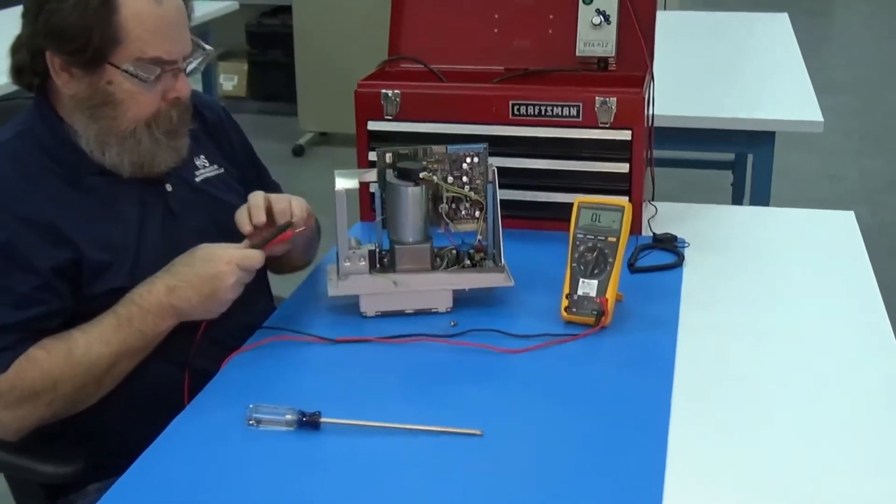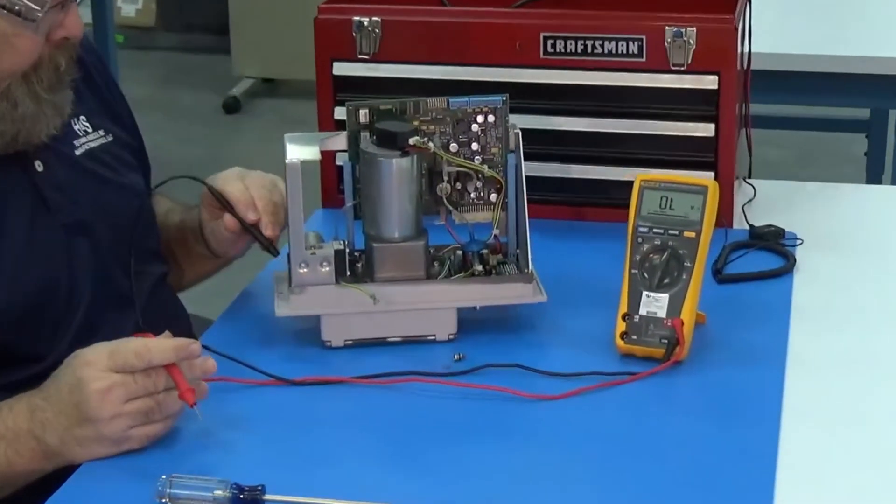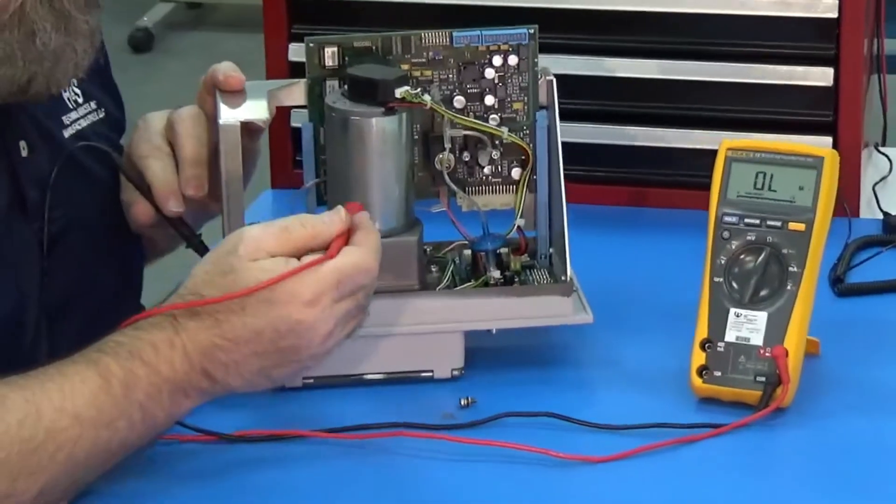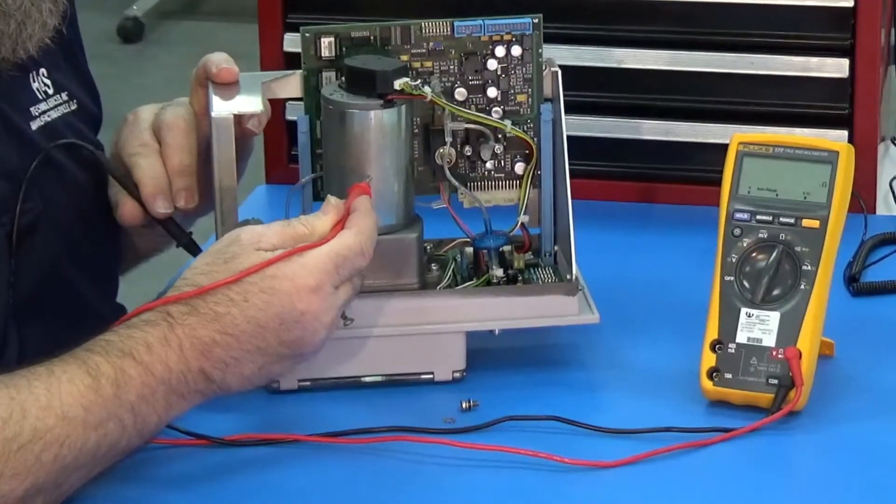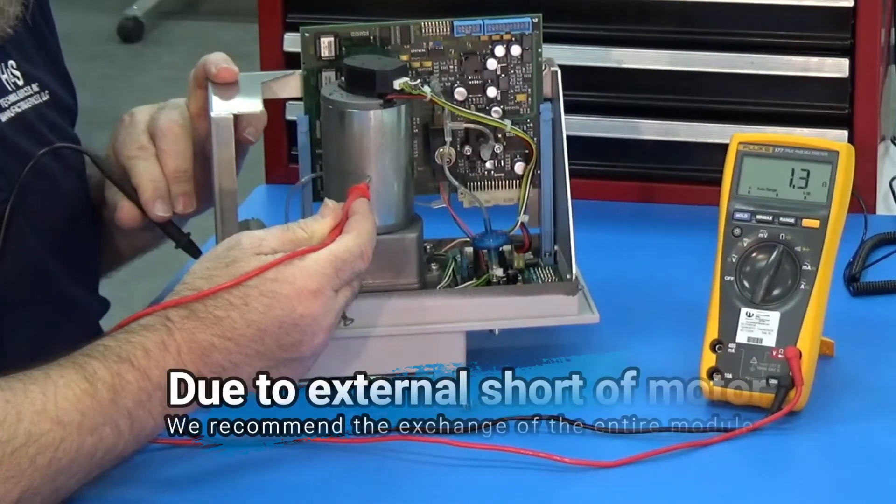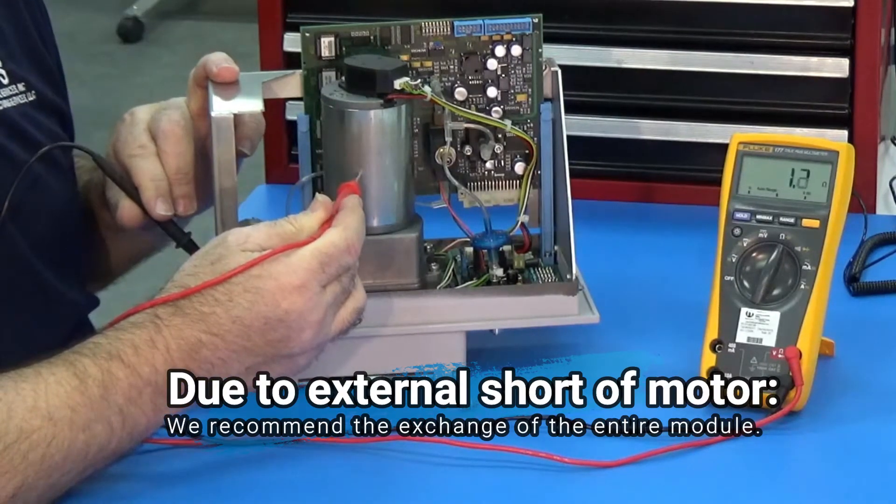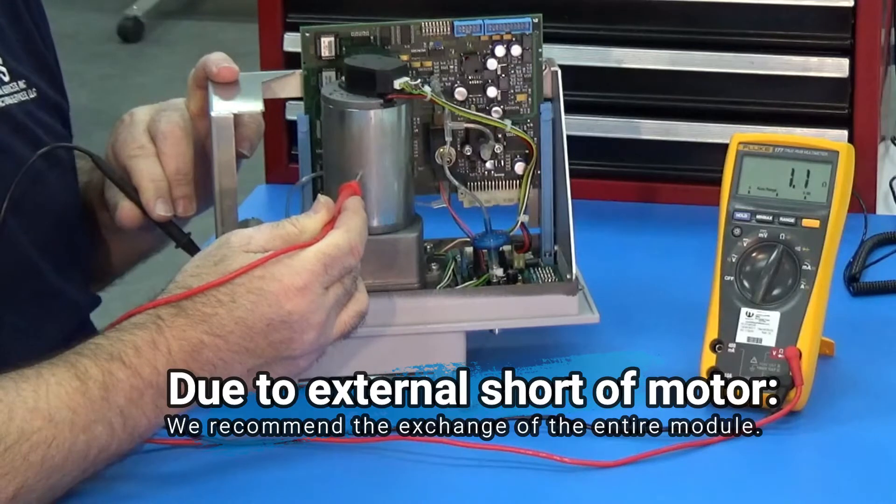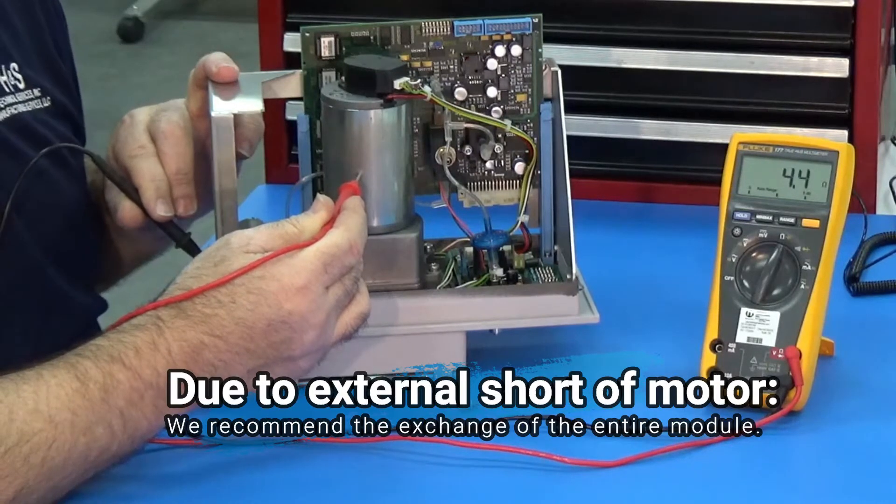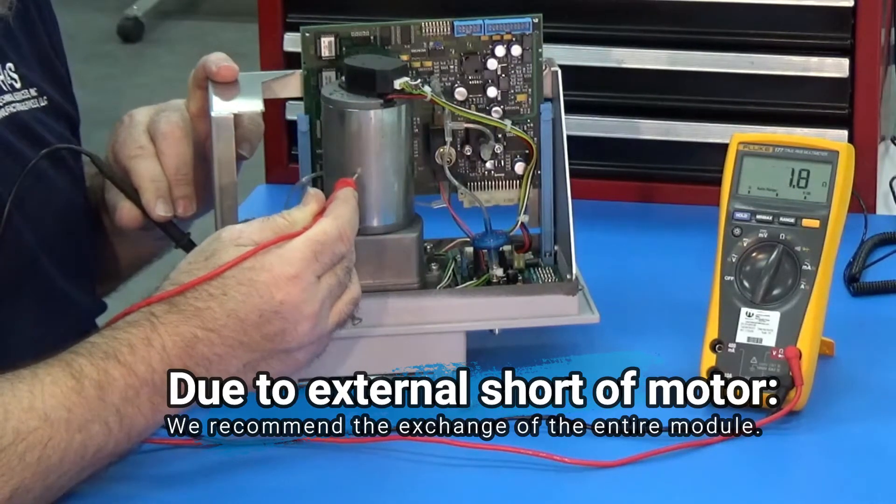And we're going to go through again and go from the chassis of the module to the chassis of the motor. And you can see that this one here has a short to ground. It measures some resistance and it is shorted and the Biomed will need to replace this entire module.